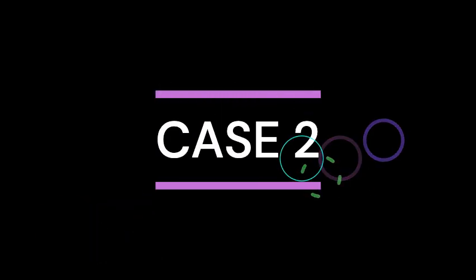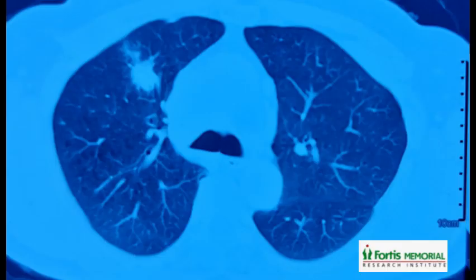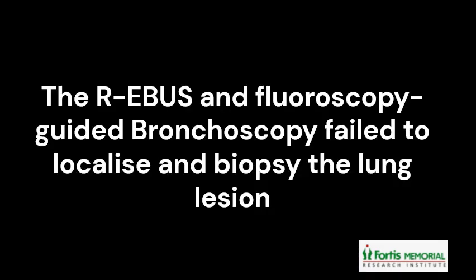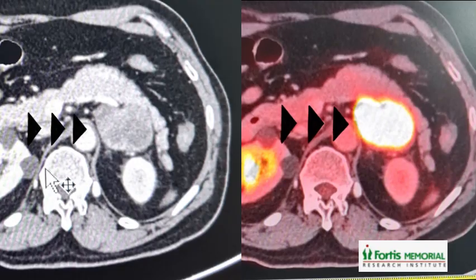Case number 2. A 64-year-old male patient presented with a nodular opacity in the anterior segment of the right upper lobe. The EBUS and fluoroscopy-guided bronchoscopy failed to localize and biopsy the lung lesion. The patient had a large PET FDG-avid left adrenal mass measuring 35 by 45 millimeters in size.